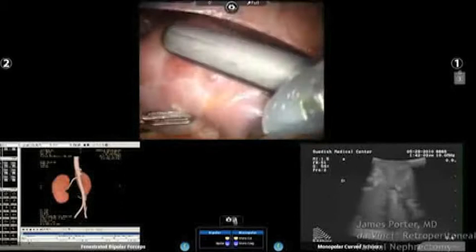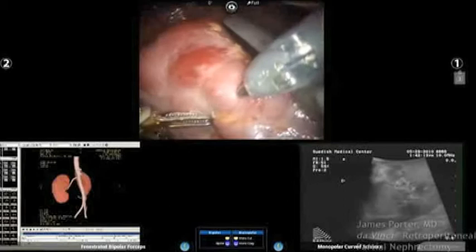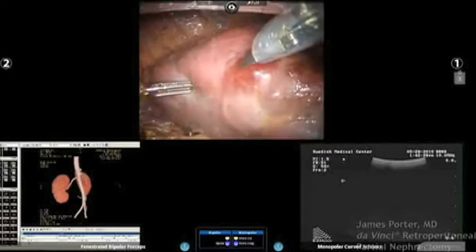Yep. So, Jim, do you lose very much right now if you pick it up and just cut it out without clamping right now, that little tiny thing? No. And send it off? I probably don't lose anything at all, but it looks like it's cystic. It looks like I could just cauterize it, really. Oh, okay. But I'm going to be making my mark. Let's look down here again, Nance. Let's make our mark down here. So this is tumor. Tumor is right here. Okay. I need your ultrasound there.